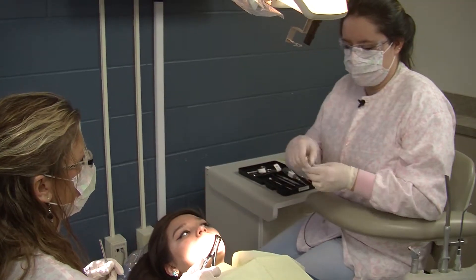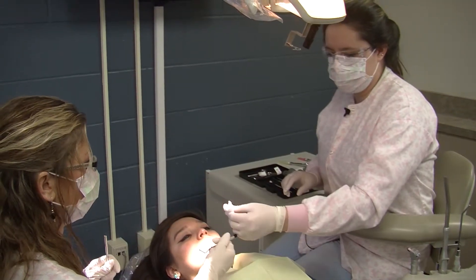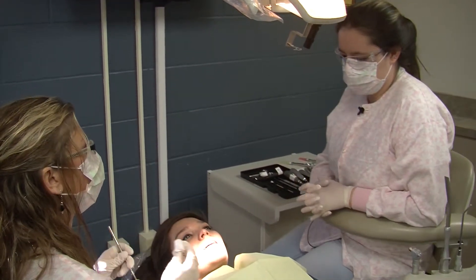Then we're going to get the curette to see if there's anything left, like a bone or part of a tooth. Then we get the gauze so the patient can bite down on them and the blood can form a clot so she stops bleeding.